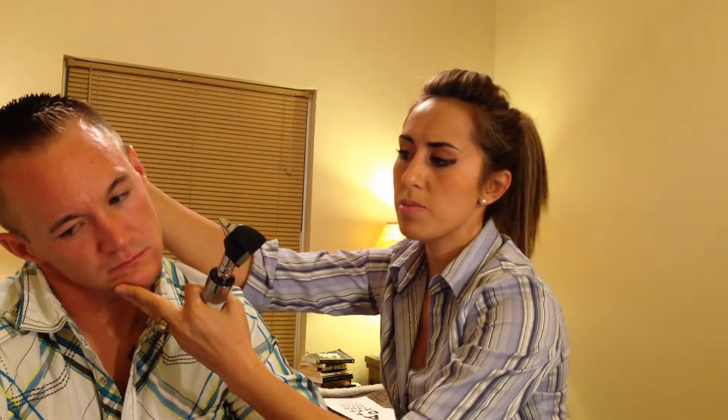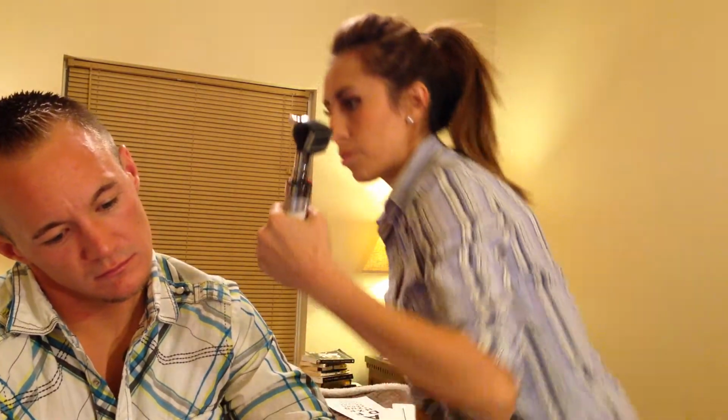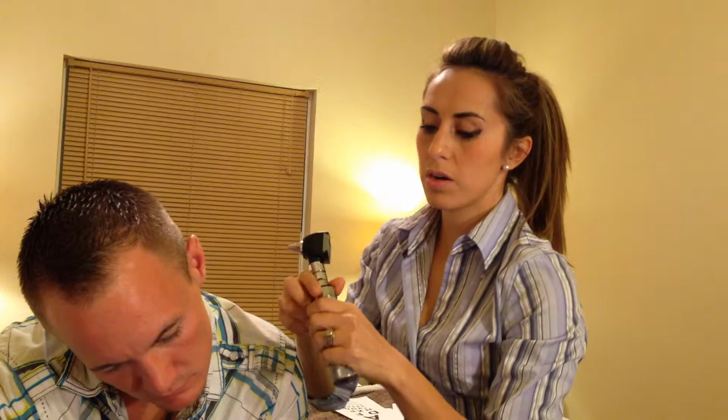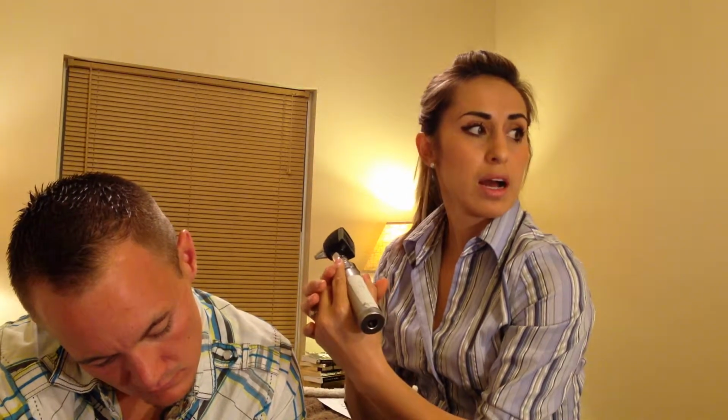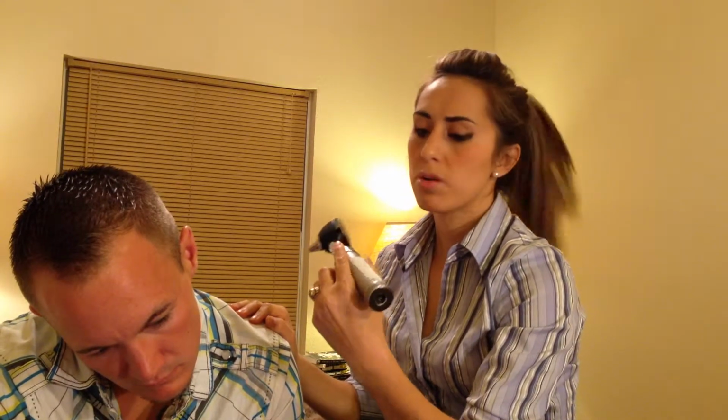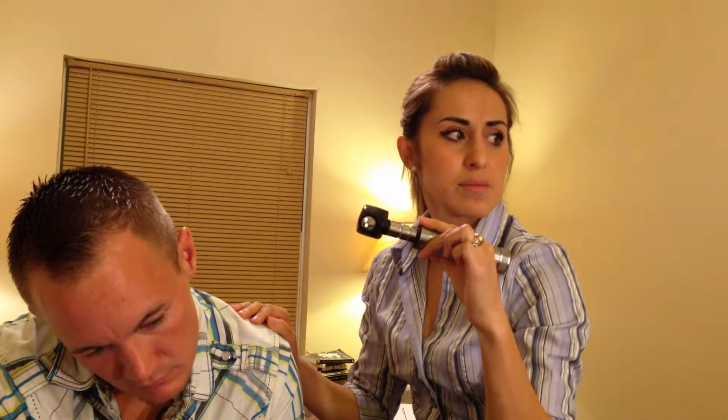So what we want to do is go ahead and tilt the patient's head toward his opposite shoulder, and we will be standing at this time. We want to hold the speculum in some manner where our thumb and index finger sit right in between, and it's supported by our middle finger, just like this.